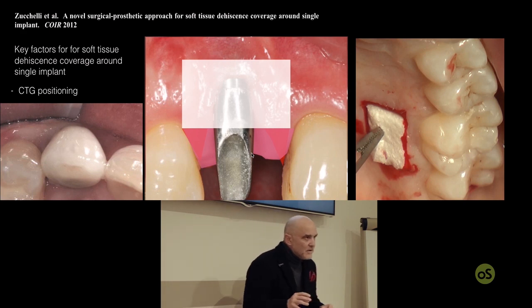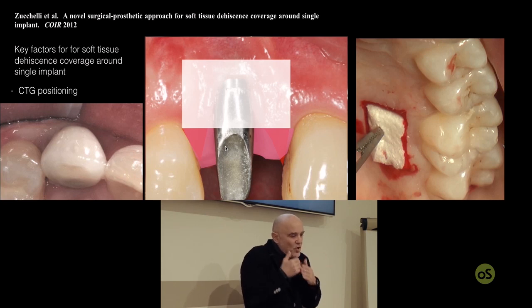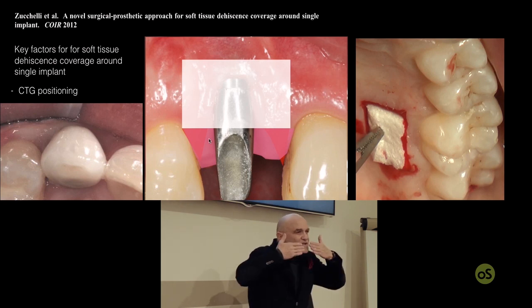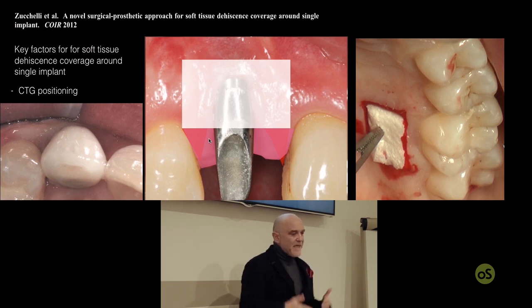So now we don't have to cover the crown anymore, but we have to cover an abutment that is extremely thin. It has been corrected in order to correct as much as possible the malpositioning of the implant, and so the papilla are much, much more buccally displaced with respect to the abutment surface, with respect to the papilla where there was still the crown.